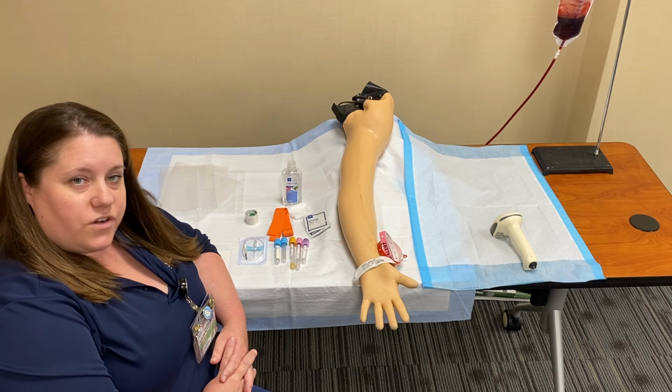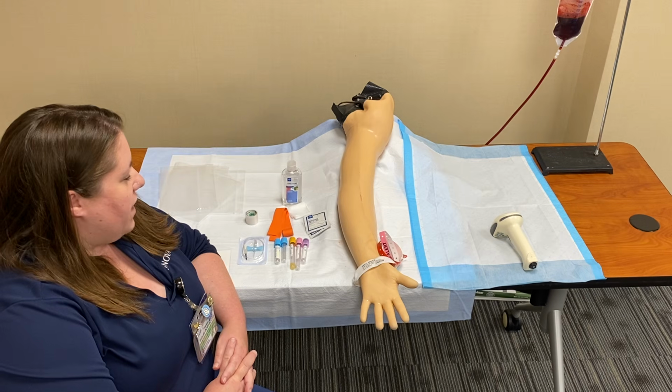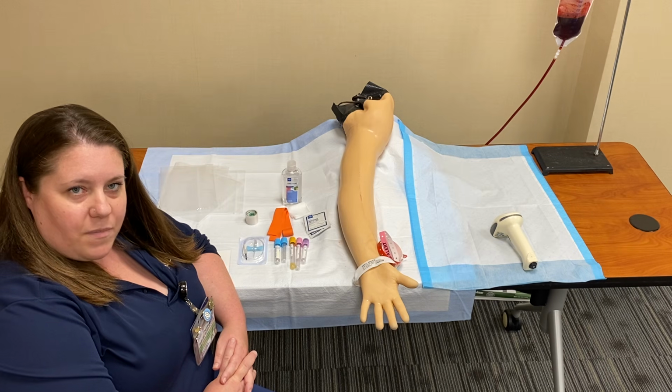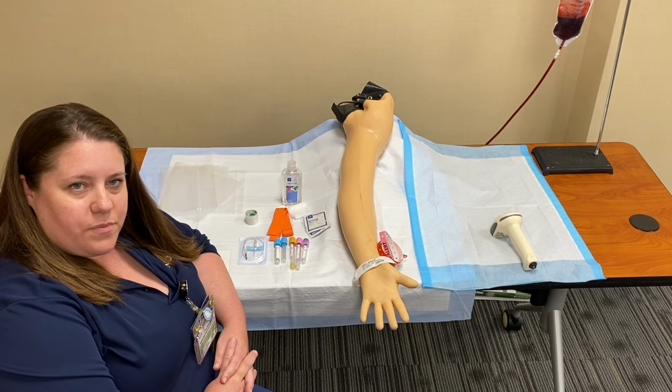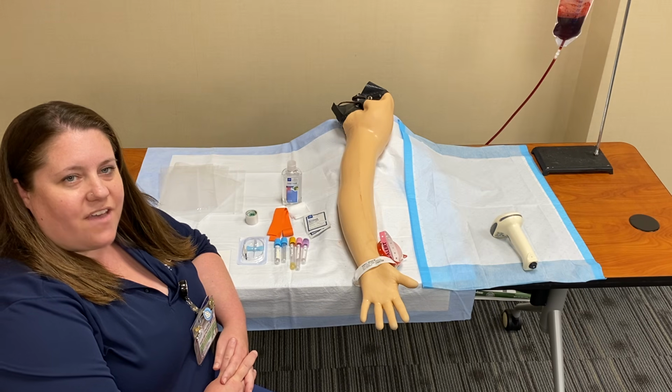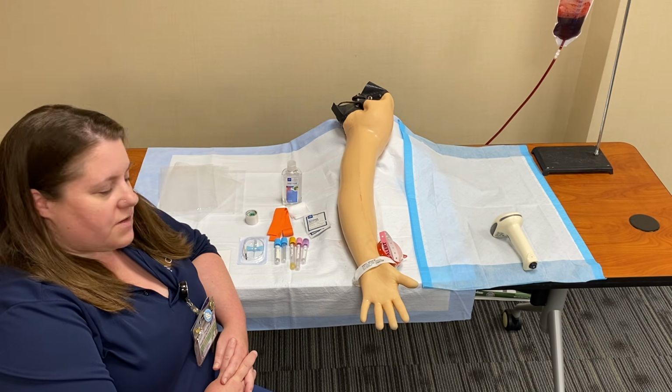I want to ask the nurse which method they would prefer I use to draw the blood, and my nurse tells me the butterfly vacutainer method. Now, it is important to ask which method would be preferred just to make sure the nurse doesn't have any additional information for you on what would be best for the patient.